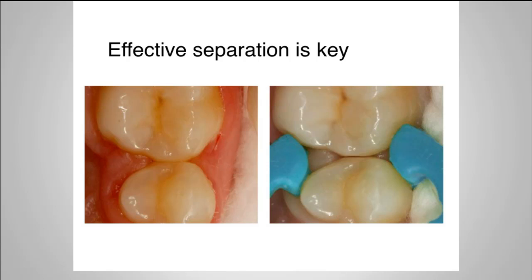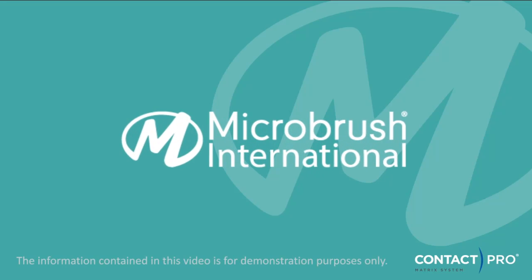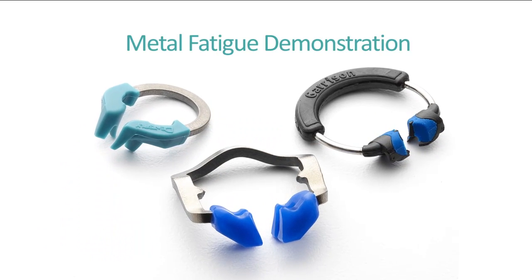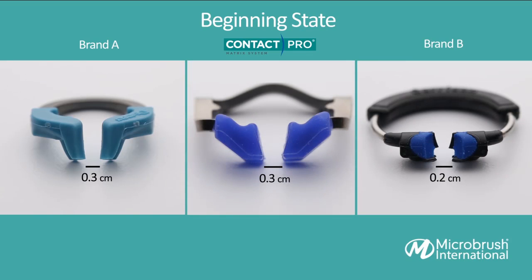As we know, stretching out the PDL ever so slightly, allowing our sectional matrix bands to be placed, removing that ring, allowing those PDLs to collapse back together will certainly give us a better contact in the long term by just PDL manipulation itself. But one of the things that's really interesting is the new microbrush, just showing a little bit of a comparison in some of the leading brands out there in comparison to the new microbrush Contact Pro ring that's out there.